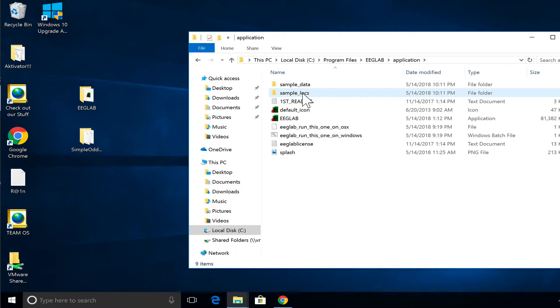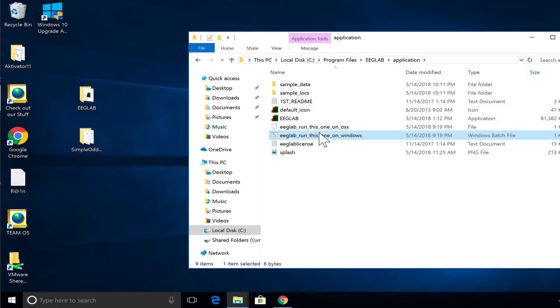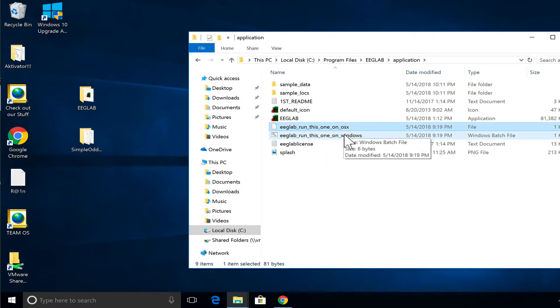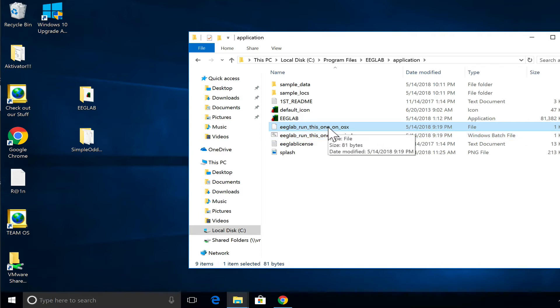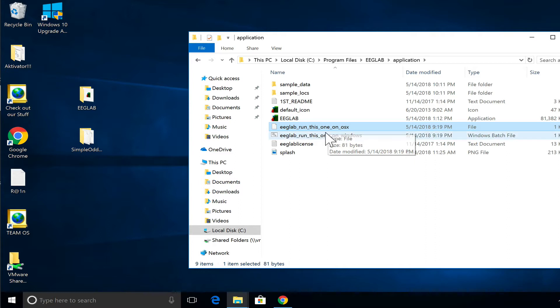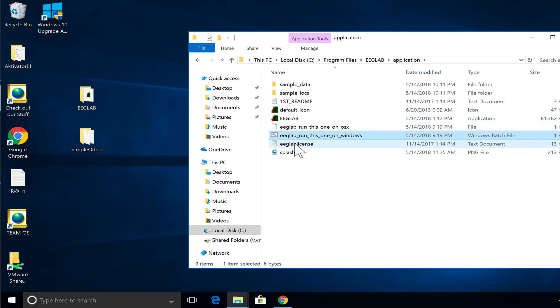If you're on Mac, it would be Applications then EEGLAB. You'll have two files: EEGLAB run this one on Windows, EEGLAB run this one on Mac. If you're on Mac you might have to left-click and make it an executable file — I'm not 100% sure it is executable by default. In any case, you can always click on EEGLAB and it's going to work, it's just you will be missing the text output.